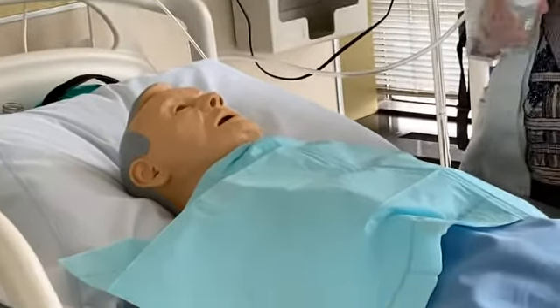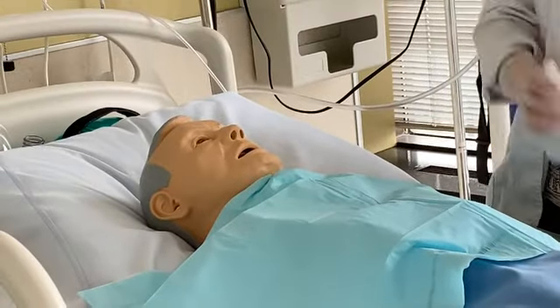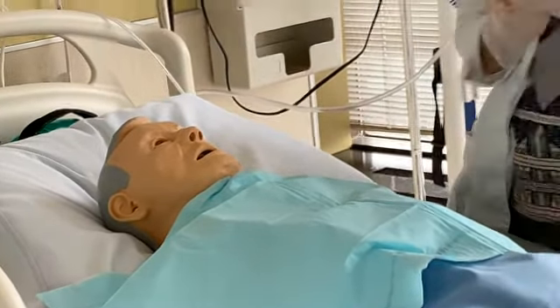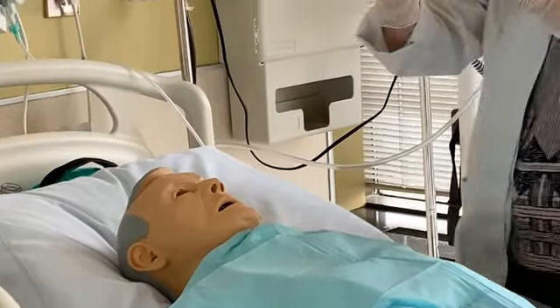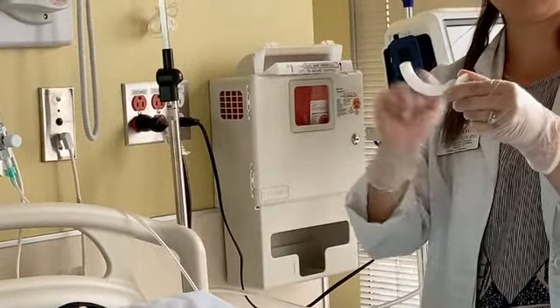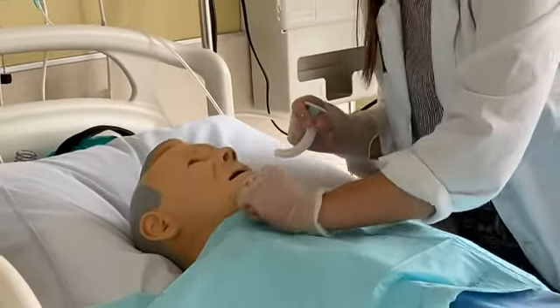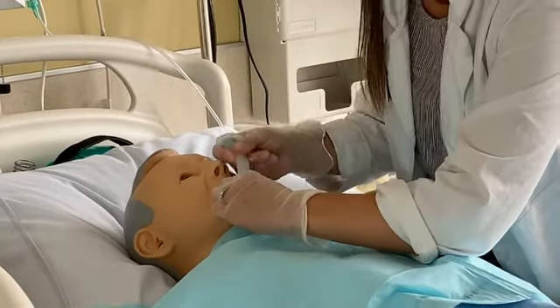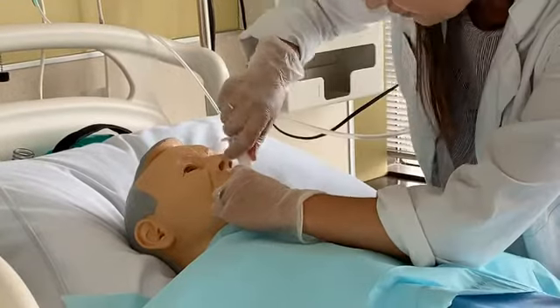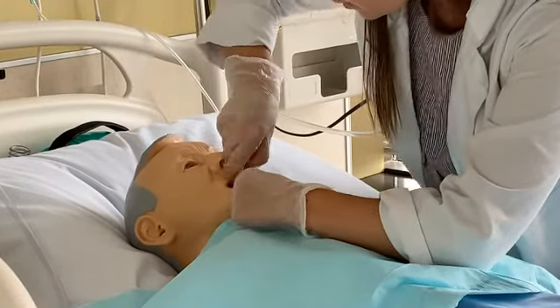Now that I'm ready, I will take the water-soluble lubricant, generously apply it to the airway, and start inserting. So the insertion happens tip up. And I will have to push the patient's head up and open their mouth at the same time as I'm inserting this airway tip up. And I'm aiming for the patient's uvula.